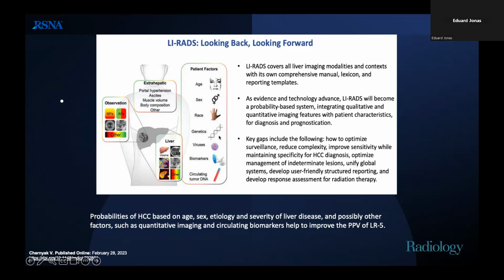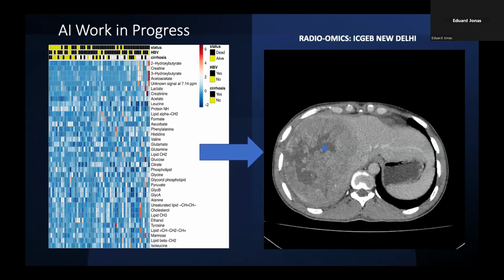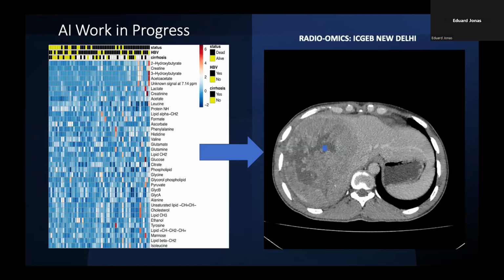I can just chip in here. I think the problem is we don't have any experience with that, because the ultrasound contrast is not registered in South Africa, and I don't think, if I'm not mistaken, anywhere in Africa. So the dynamics of the contrast is a little bit the same as you would have for any intravascular contrast. Yes, definitely. We're not doing any contrast enhanced ultrasound, at least in South Africa, as far as I know.